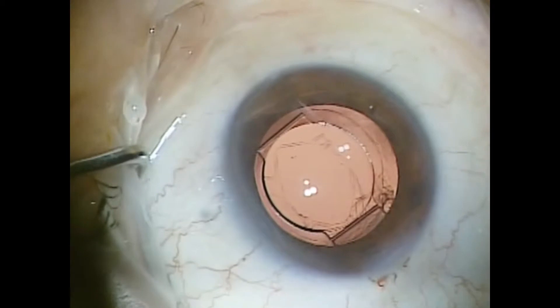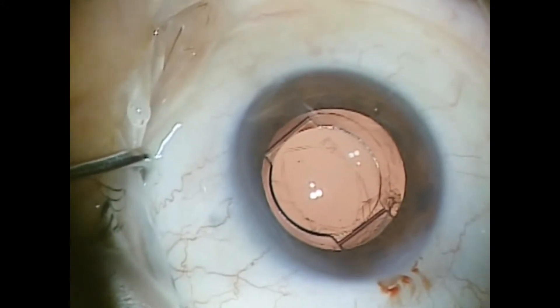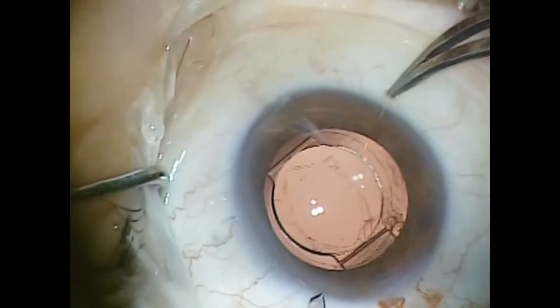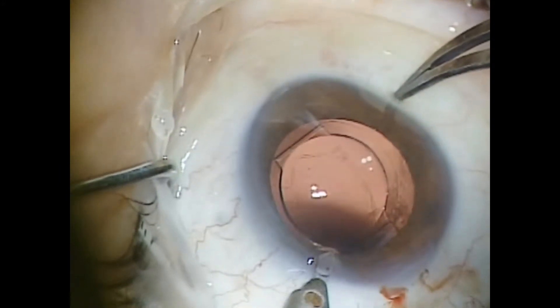I make a long incision at the main incision site. As you can see, the posterior capsule has been opened by YAG laser capsulotomy. I find this gives a more accurate refraction prior to measurements for power for the lens.